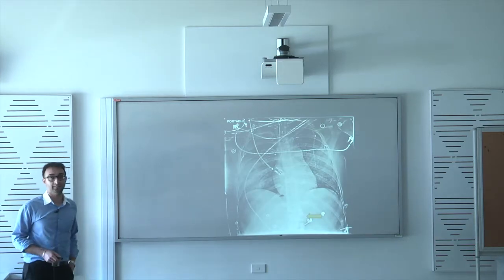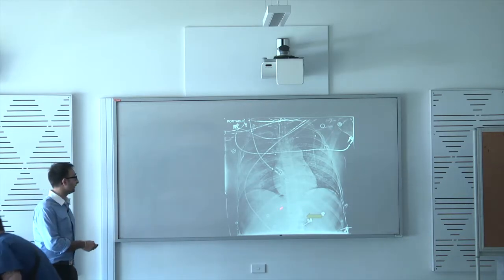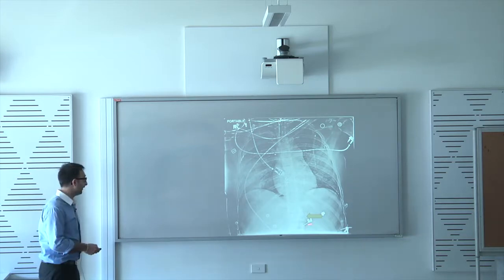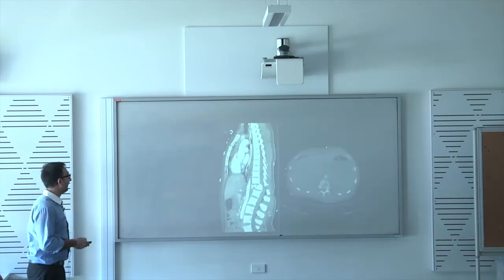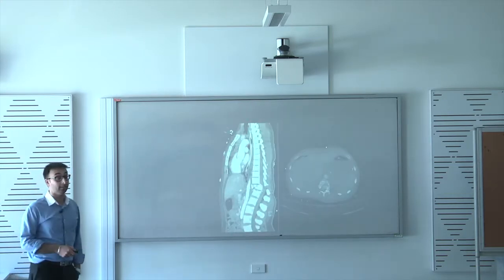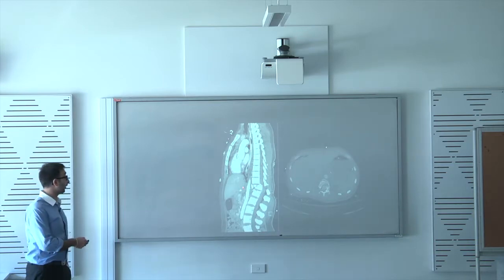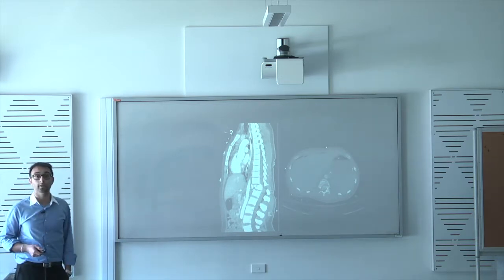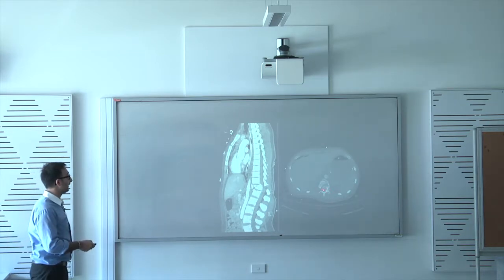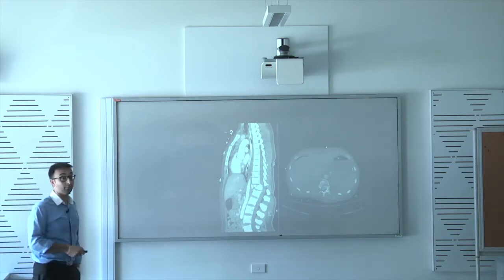But also what they do have, and this is quite hard to see, and I don't think everyone will walk past this, is a bit of some osseous fragments down in the thoracolumbar spine down here. That's very helpful to have this arrow. Unfortunately, our images don't come with arrows. They also have a fracture involving the thoracolumbar junction, as you can see. This fracture involves the vertebral body. It goes right through the posterior elements, and there's widening of the interspinous process. We can characterize this as a three-column fracture, and a Chance fracture is what we'd call it. As you can see on the axial CT, there's a lot of fragments that have been retropulsed into the spinal canal, and I assume the spinal cord is not very happy.